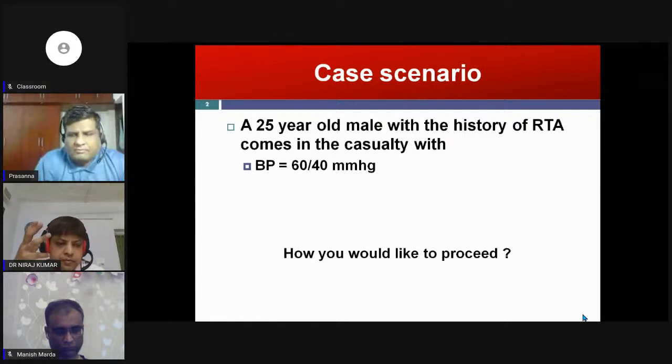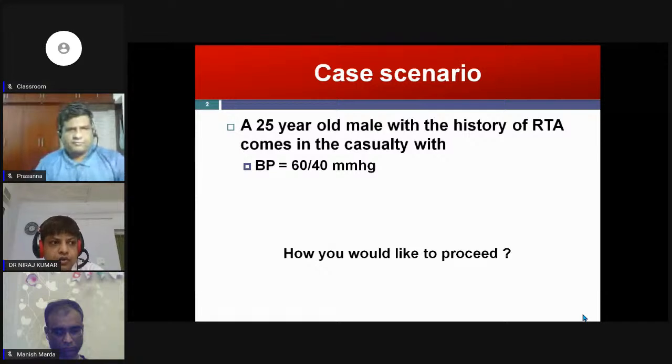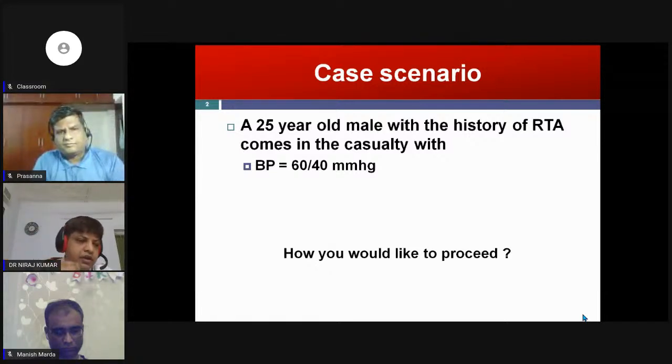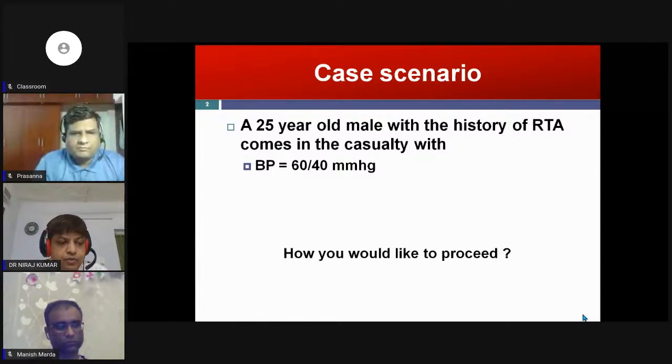Suppose we have a patient in shock, you just keep your cardiac probe above the chest, you can see the pericardial effusion. So you come to know that patient is suffering from a tamponade. Suppose in another condition the contractility is reduced, so you come to know that patient is suffering from cardiogenic shock. So you give inotropes. So ultrasound helps in making the diagnosis very accurate, so that the clinician has the confidence to move to further management.